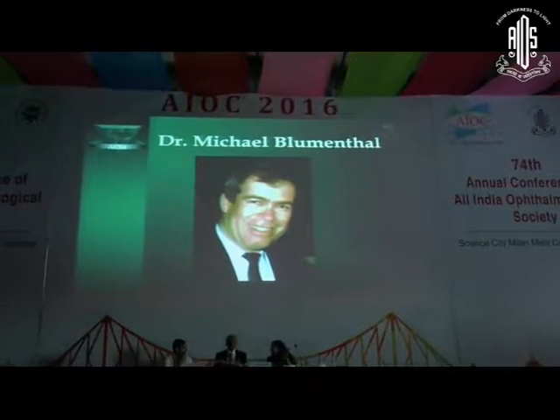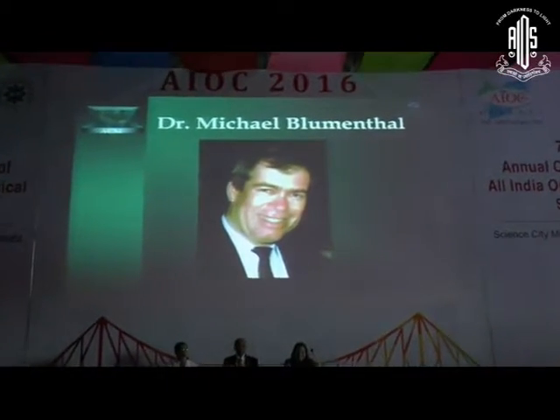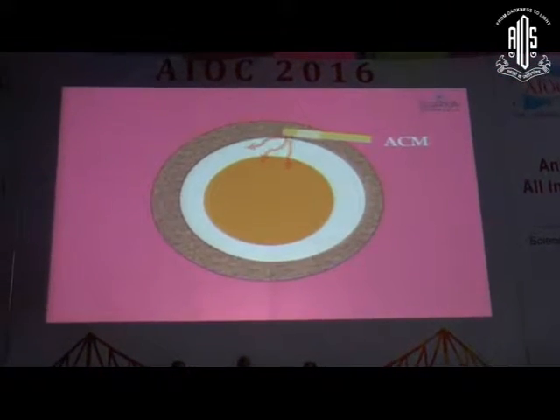I am going to speak on the anterior chamber maintainer, a tribute to Professor Blumenthal. He has not invented the anterior chamber maintainer, but he has extremely popularized it through his Blumenthal's closed chamber technique. The anterior chamber maintainer is a small cannula which is introduced at the lower end of the cornea to maintain a sustained fluid pressure in the anterior chamber.